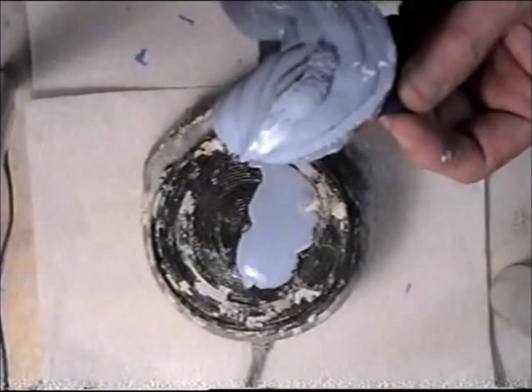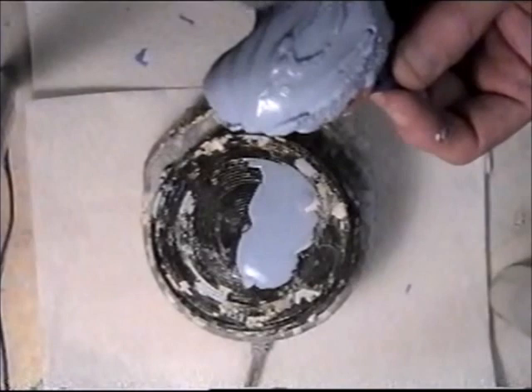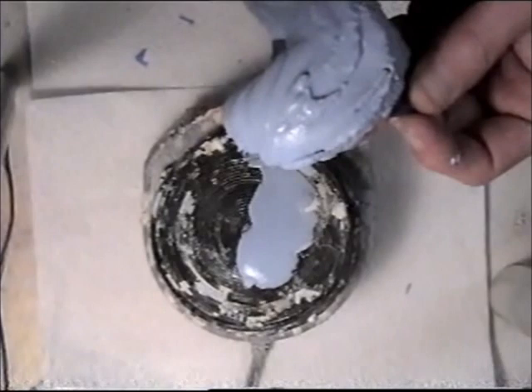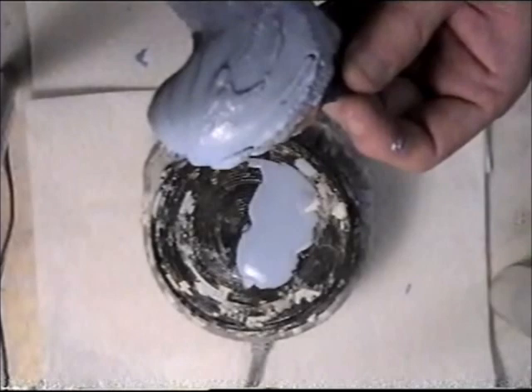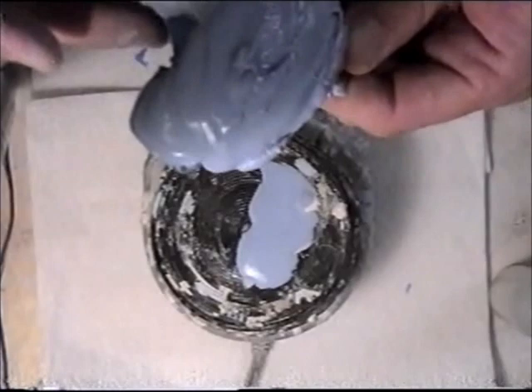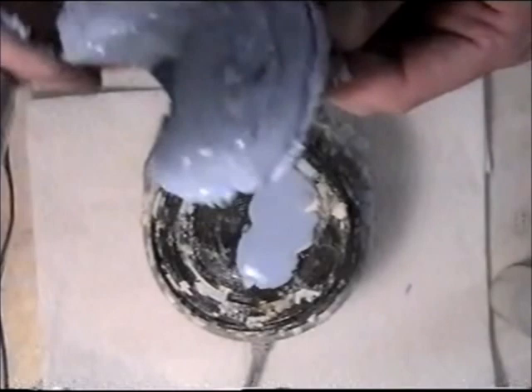So it's looking pretty good now. I can just play with my stone here. It's still a little wet. I'm going to probably add a little bit more, but this is basically all we're going to do for right now. I'll continue to add a little more, and any excess that's flowed over the tray I'll cut away, so it'll be easy to separate, and then we'll go to the next step.